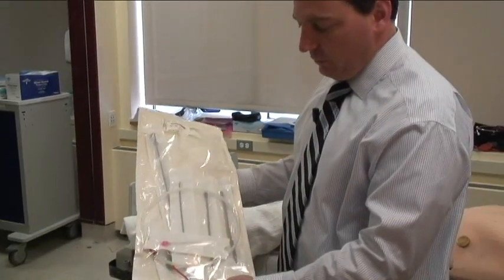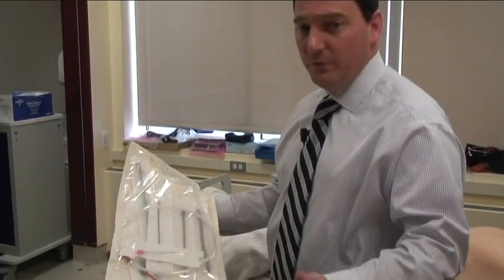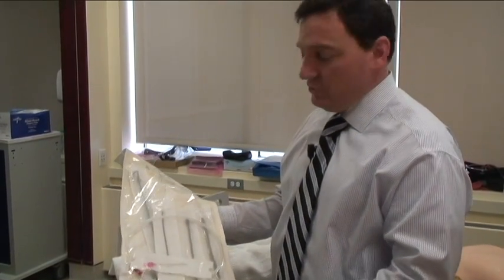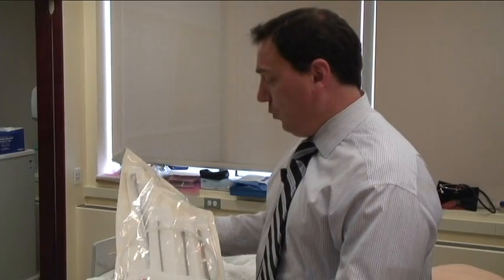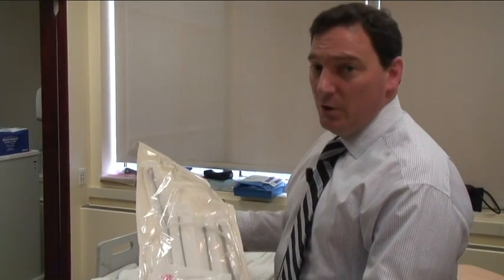This kit is what I call a bare bones kit. It doesn't have all the gauze and the lidocaine, so you will need to assemble that separately. You may need to use these for some effusions that are particularly thicker liquid, or if someone has a large air leak on a ventilator, you may want to use a larger tube.